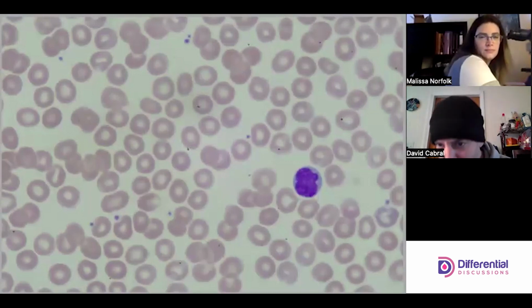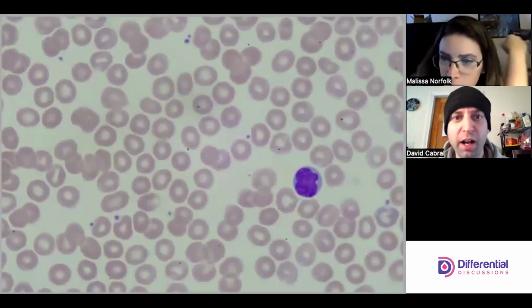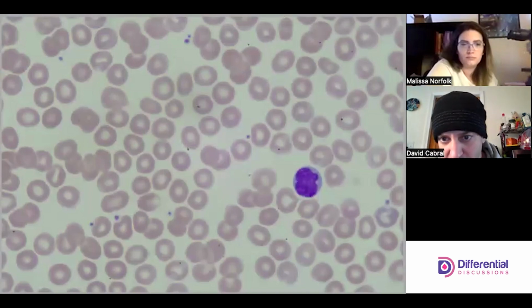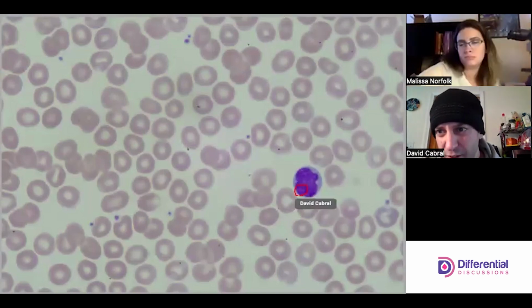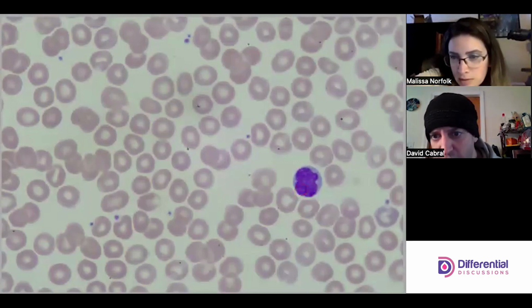Okay. So it's tough, but with the recording and stuff, that looks like a nucleoli. Is that what you're seeing on your side too? No. Okay. All right. So clumpy. I want to keep looking, okay?